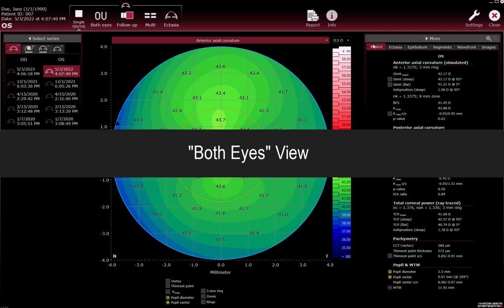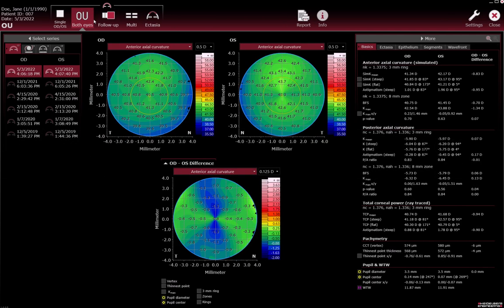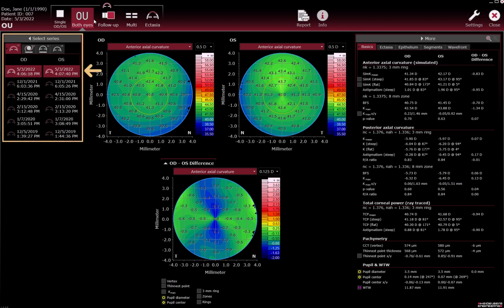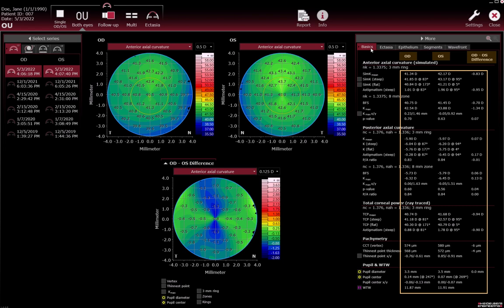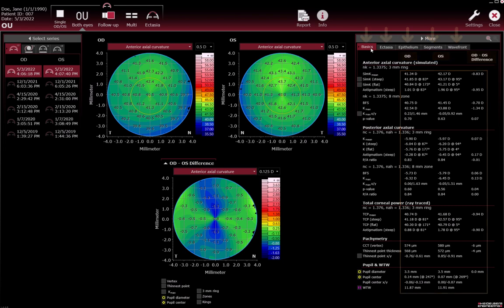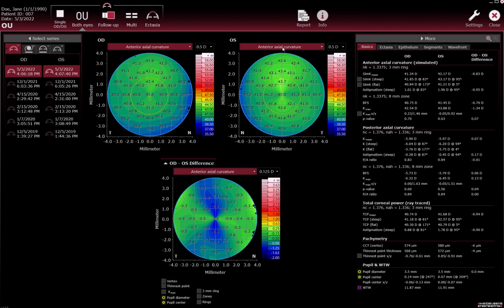Both eyes view. The examination of the other eye, if it has been performed on the same day, is automatically pre-selected in the Selected Series section. Values for OD/OS and the OD/OS difference are displayed in the More section in all tabs. The OD/OS difference map shows the difference between the examination series of the right eye and the left eye. Adjust the colour map in the drop-down list.